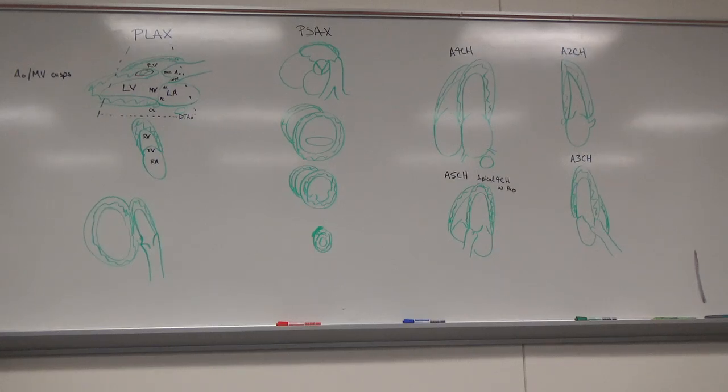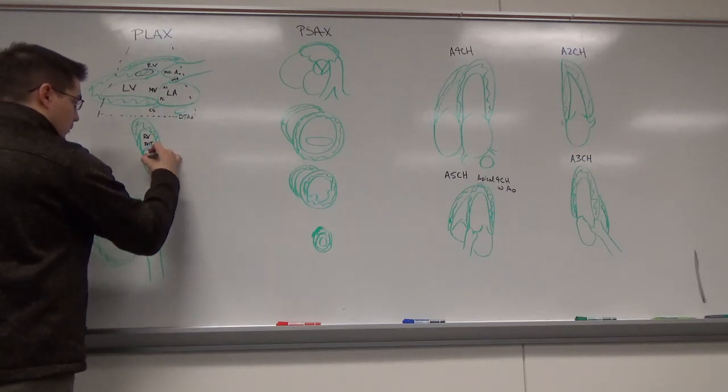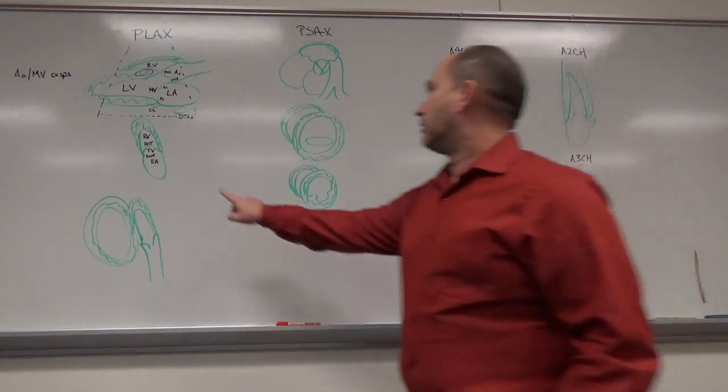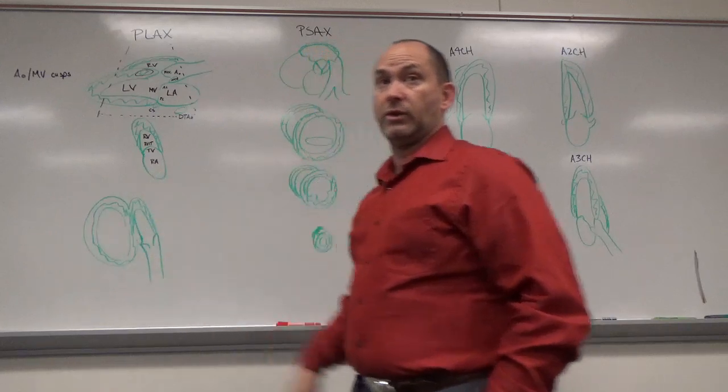So where the tricuspid valve dumps into the right ventricle, do you think that is an outflow or an inflow? You're talking relative to the ventricle. It's the inflow. So when we talk about this, we're going to use the terms interchangeably. So this could be called, yeah, the RVIT or RVOT. It's going to be the outflow. Good. So this is not going to be RVOT there, though. I'll erase that. So we're just going to be talking about it relative to the ventricle.